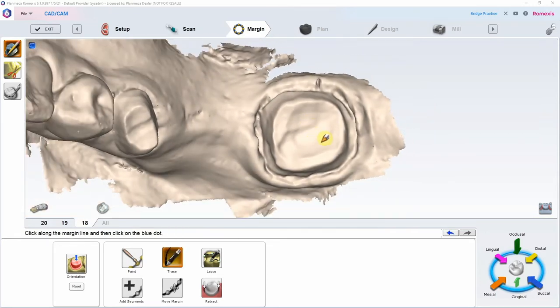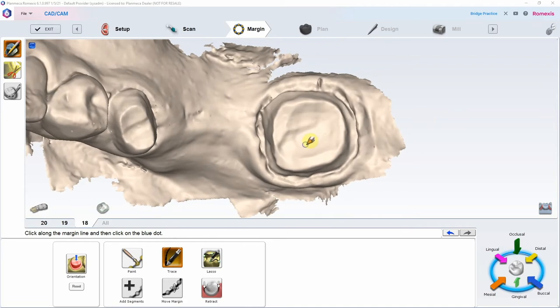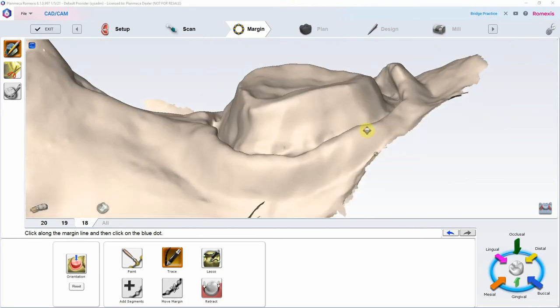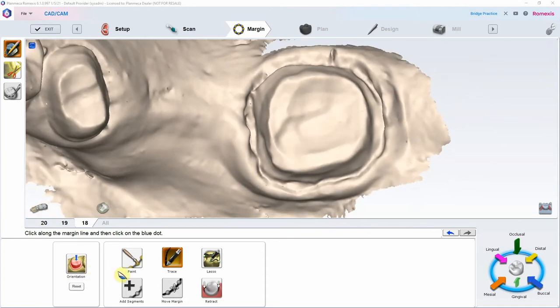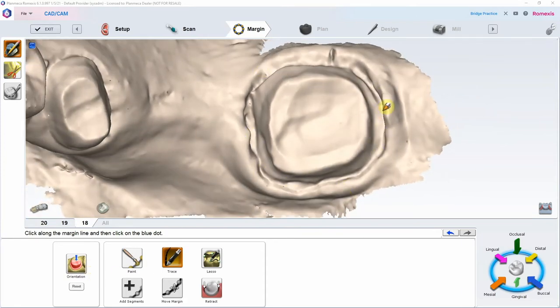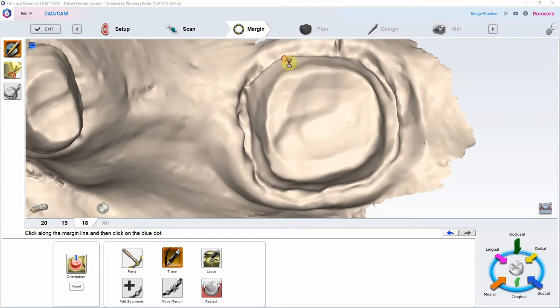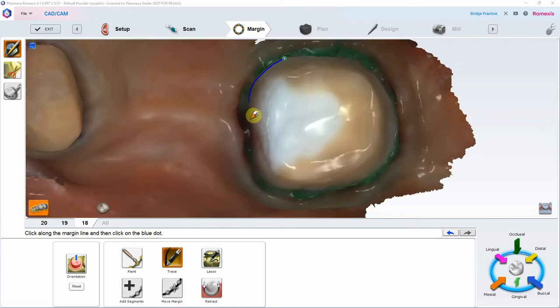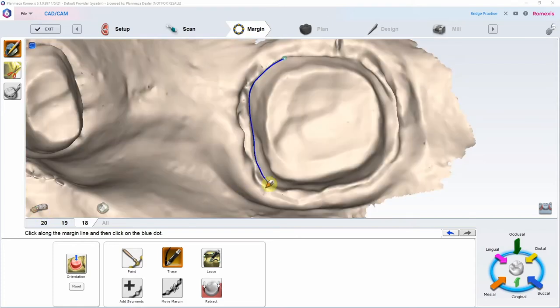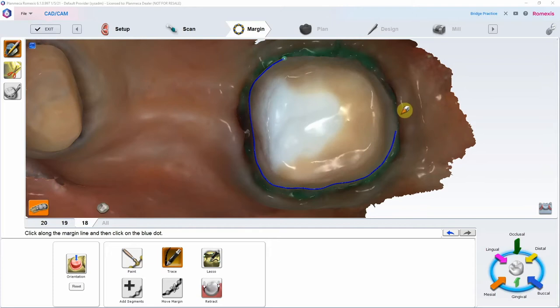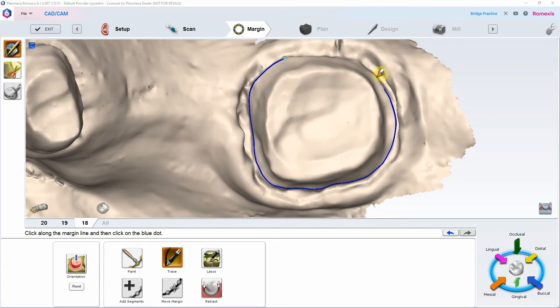Now let's mark our margin. For subgingival finish lines like this, I'm going to use Trace — trace means that wherever you put it, it goes. I'll draw it along my margin. If you want to do it in color you can, but I have really good retraction so I'll do it in stone view. I like to toggle back and forth, but for the most part I mark in stone. Subgingival areas sometimes in color.